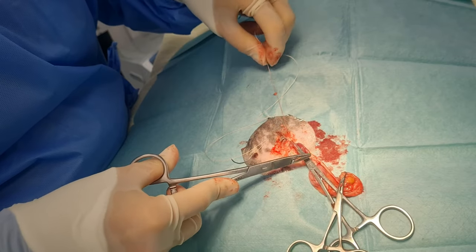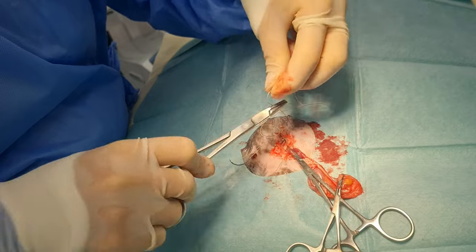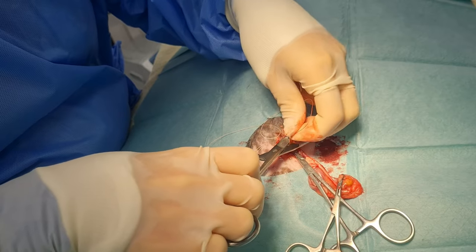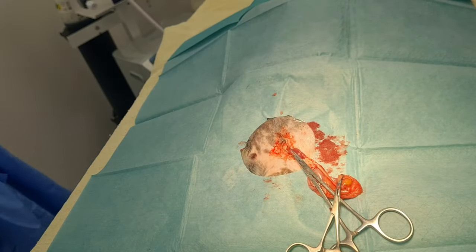With my bigger boys, particularly when they are already sexually mature, I do think this tunic inversion is a worthwhile adaptation. We're using a 3-0 braided absorbable suture.